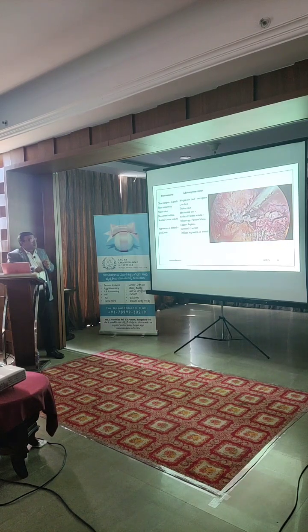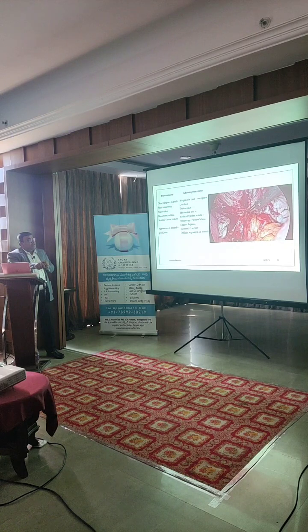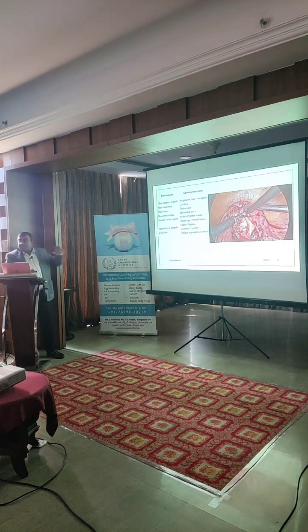So you can see superficial outer myometrial lesions of adenomyosis here. These are the cystic lesions in the outer myometrium. This is the rectum which is stuck to the posterior aspect of the uterus, and then the rectal shaving also will be done. So the rectum is released. Here it is very densely stuck to the torus, so I am using the scissor to release the rectum.